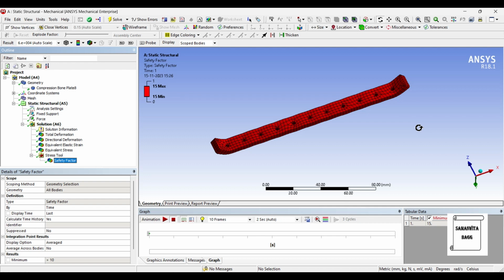Again, I'm repeating that this analysis is of static operation time. This is not dynamic one. Generally, these plates show dynamic loading because the body is going to move of the patient. He is not going to be stationary. So once he moves, it is possible that more compressive load is applied on the plate. So accordingly, also you can get some results. But for that, this analysis won't work. This is only showing you the results for static structural analysis.